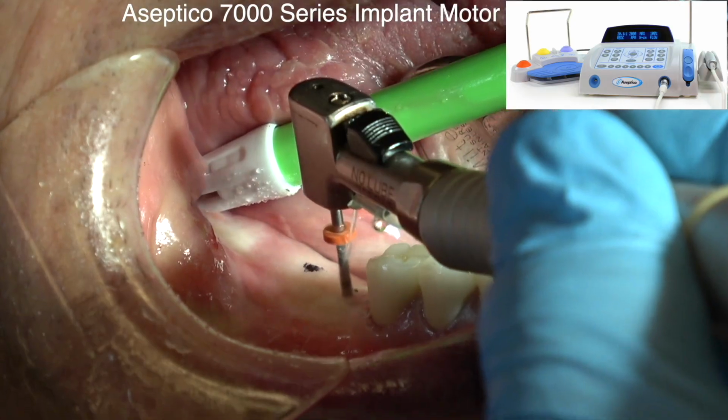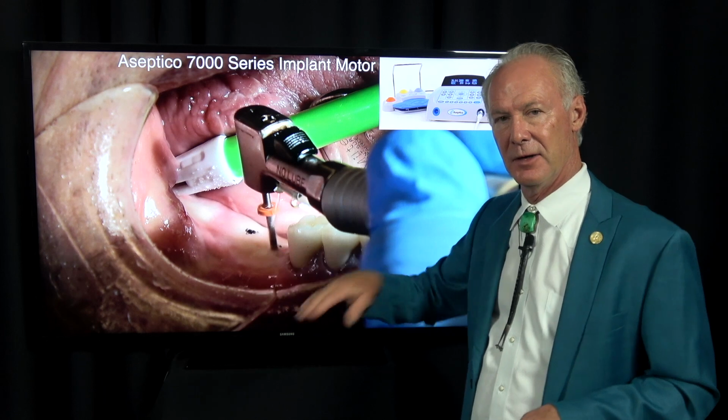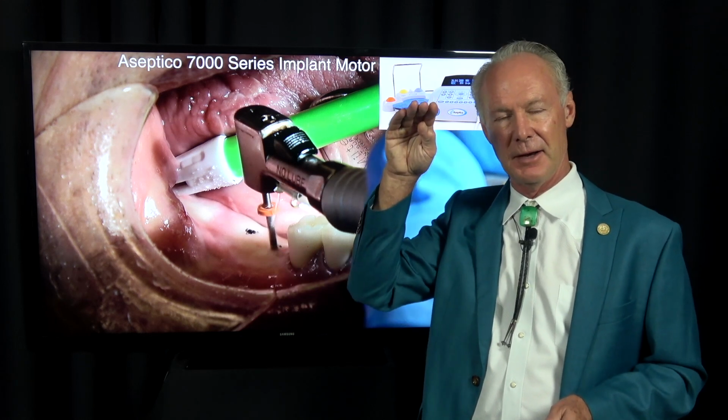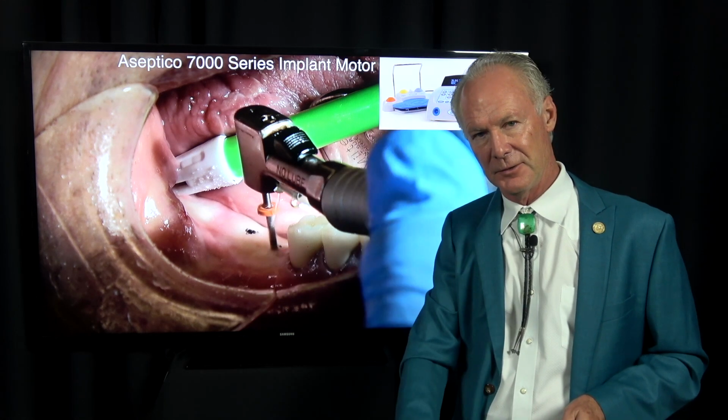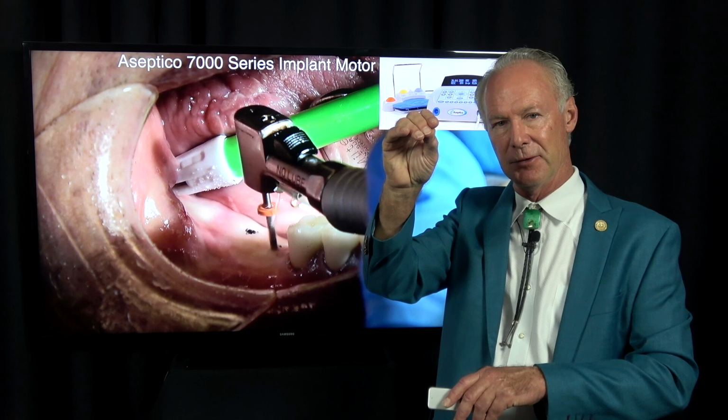This is safe. The idea is you want to be at least 2 millimeters in a perfect world from the superior part of the inferior alveolar nerve. So I've had to add 2 millimeters of gingival height to the measurement from the alveolar crest to the superior part of the inferior alveolar nerve. Think about that. So bone is 13.85, add 2 millimeters.